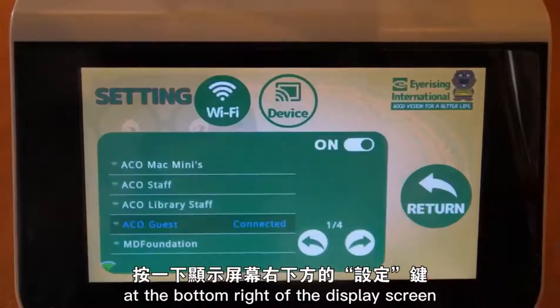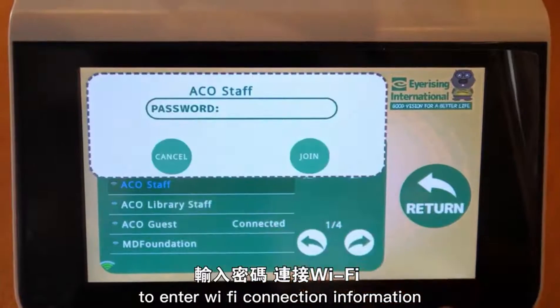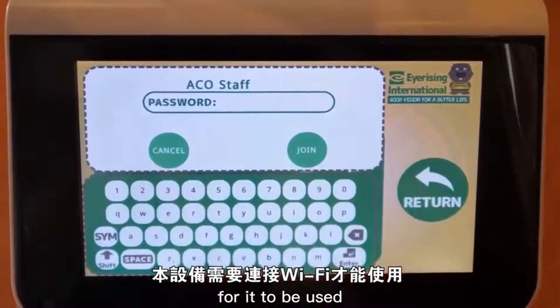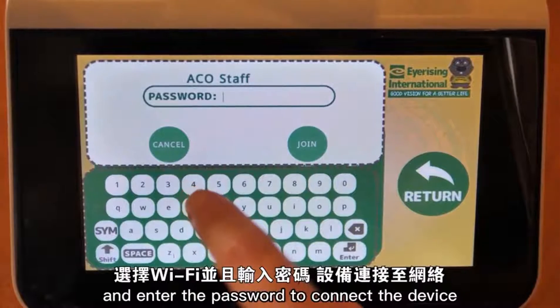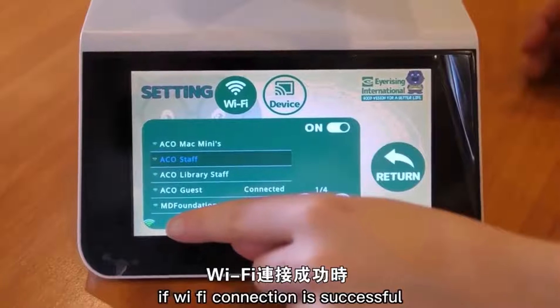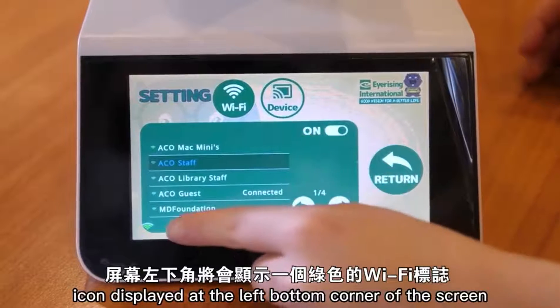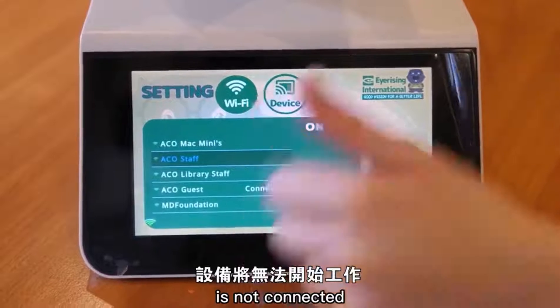Press the settings button at the bottom right of the display screen to enter Wi-Fi connection information. This device will need to be connected to Wi-Fi for it to be used. Select Wi-Fi and enter the password to connect the device to the internet. If Wi-Fi connection is successful, there will be a green Wi-Fi icon displayed at the left bottom corner of the screen. You cannot start the treatment if the Wi-Fi is not connected.